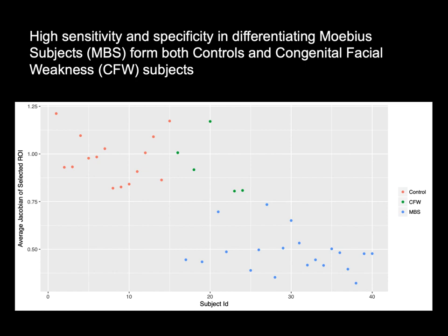One thing that is also important is that the Jacobians are typically smoothed out a little bit, and these are all technical aspects that are open for discussion because, for instance, even within our own group, Okan is always skeptical because you can actually break the tissue, right? So if you smooth out too much, you are essentially averaging across structures that are not similar to each other. If you don't smooth, then you can break the field, and then you start having negative Jacobians, which is clearly pathological. But it's true.